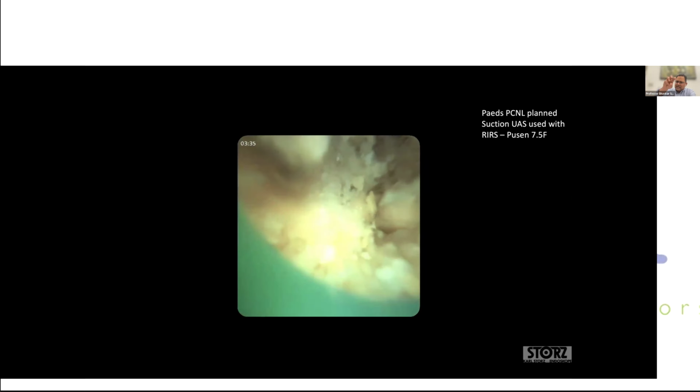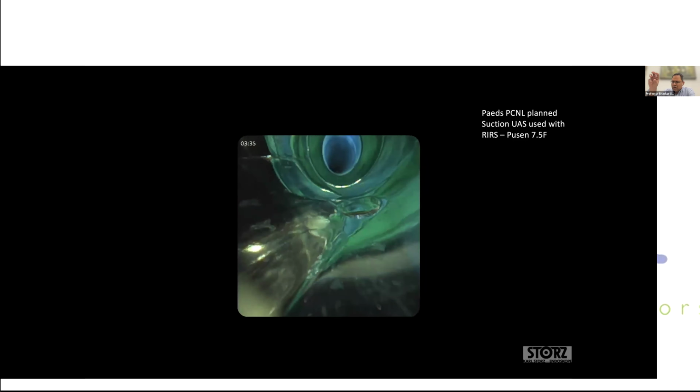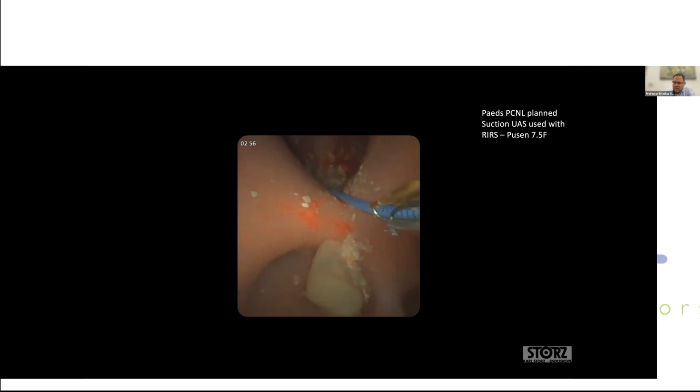The question that some people ask: do you have to use a basket? I tend to for most of the cases, because sometimes you can see here, there's a little bit stuck there. Sometimes there's a bit of clot and the fragments are stuck on the clot. I like to remove everything, so I use it. You don't have to use it in all cases. In some cases, you might be able to just keep sucking out this way.